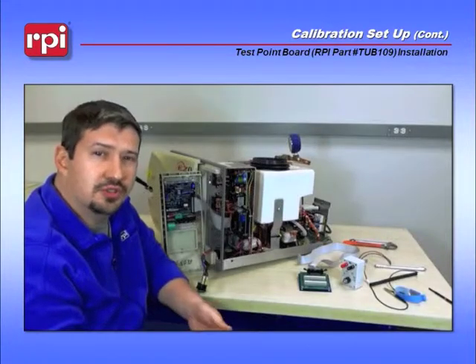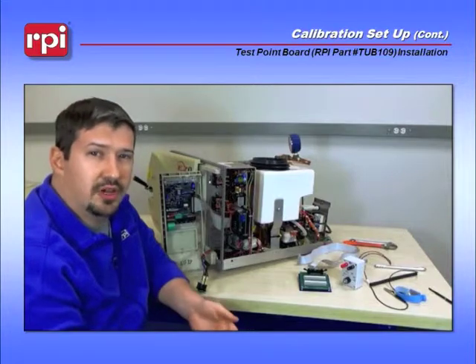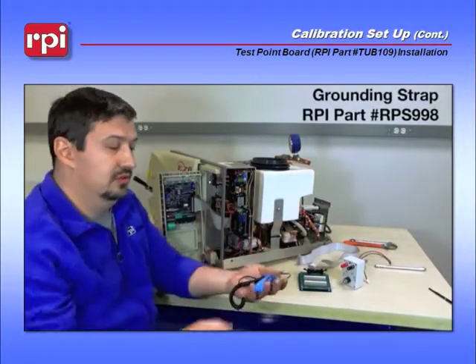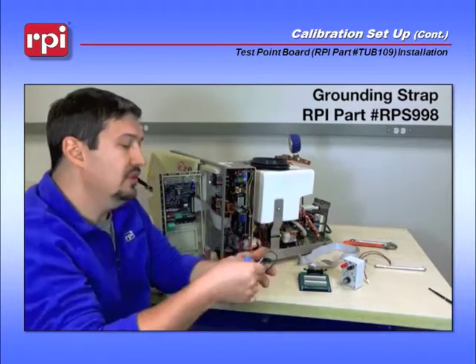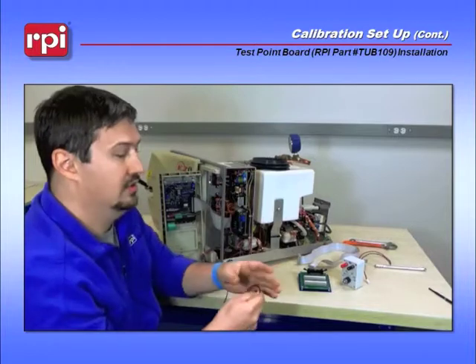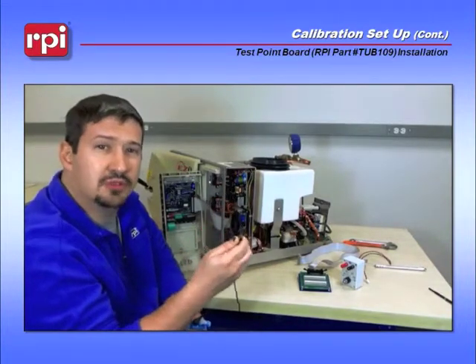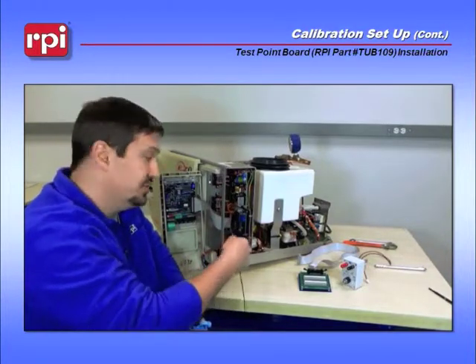The next thing you want to do to avoid any electrostatic discharge is to place on a grounding strap. The RPS 998 is perfect for this job. Place the wrist connection around your wrist, take the alligator clip, and place it on any metal screw going through the casing. This one in the front is perfect for this job.